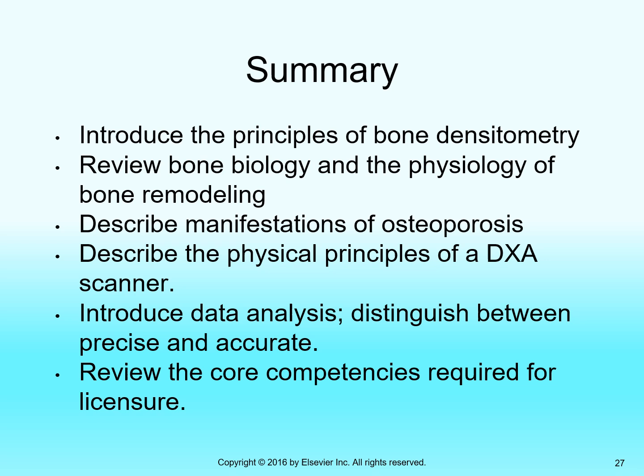Typically the DEXA machine, DEXA stands for dual energy X-ray absorptiometry, so the machine should be utilizing a low kVp exposure and measuring attenuation data from the low exposure, and then measuring attenuation data from a high energy exposure in follow-up, and then there's a subtraction of the two data sets. The data analysis usually involves calculating an average bone density at multiple different measurement sites or multiple measurements in the same visit.